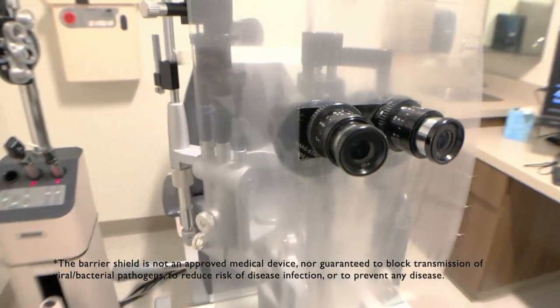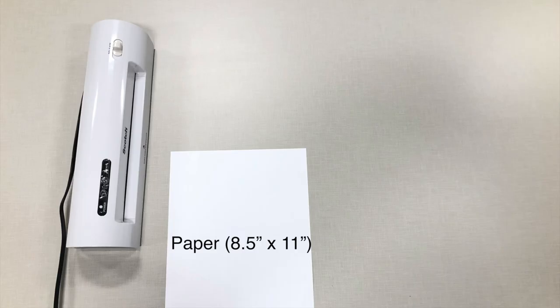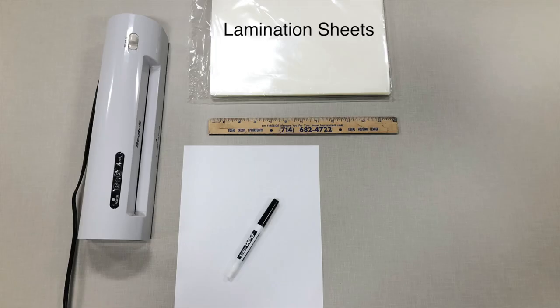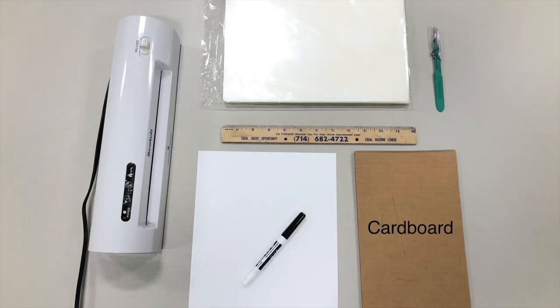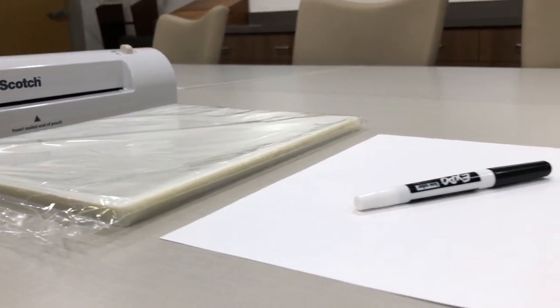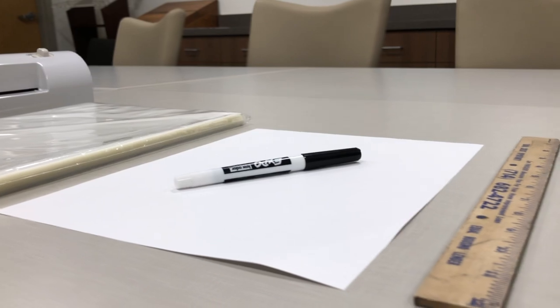For this, you'll need a thermal laminator, a standard piece of paper, marker, ruler, lamination sheets, blade, and cardboard. A thermal laminator can be purchased for around $20 and may be more economical than purchasing heavier transparent paper.